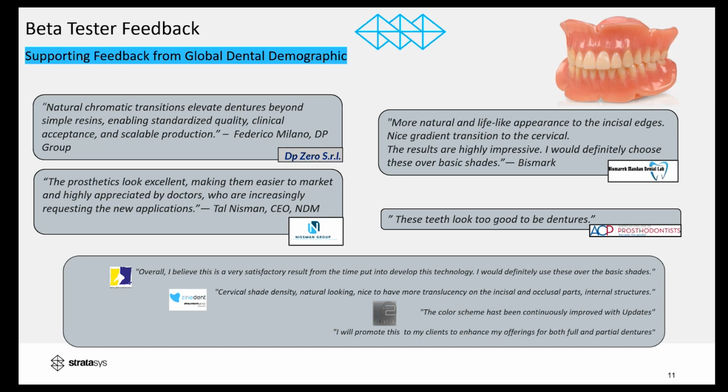Perfect. Thank you, Lior. I appreciate that. And can you discuss real quick design limitations? So can you use this on a single crown and bridge or temporary crown and bridge case, things like this?